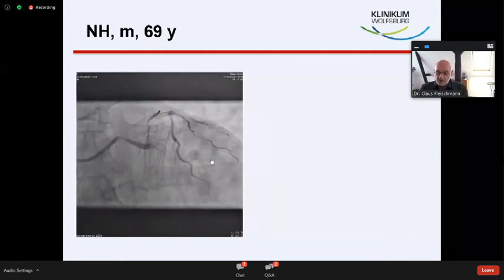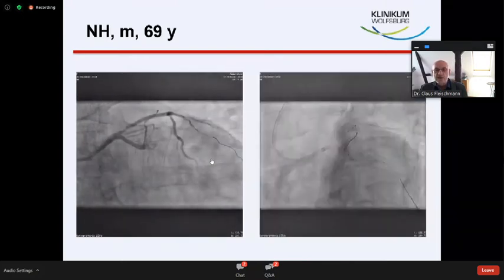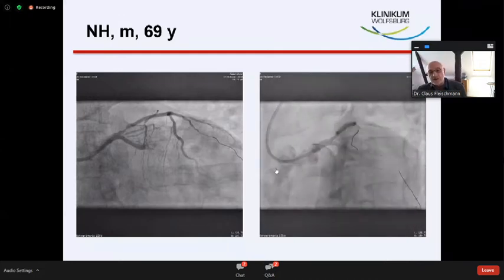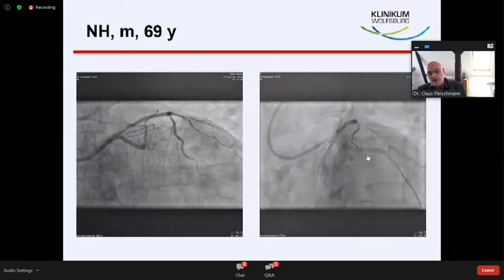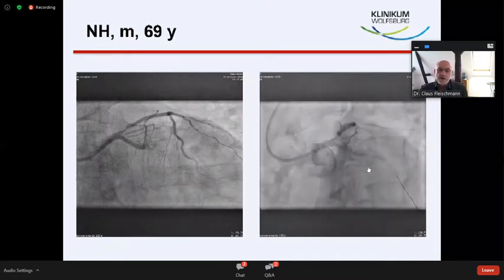reassuring. So we have a good start with a little bit luck, but we did want to wire both arteries intentionally. So it was not very difficult to get through the circumflex occlusion. We have a high-grade lesion now, but we have flow, not TIMI3, but TIMI2. We can see the course of the artery. We can see the short stenosis, not much thrombus, so no thrombus aspiration required.